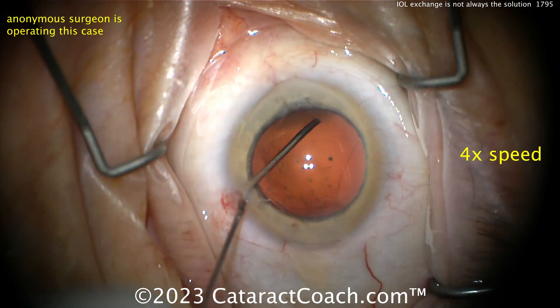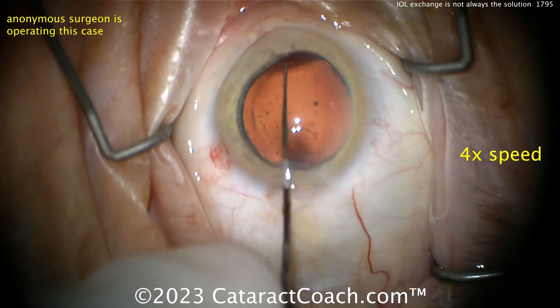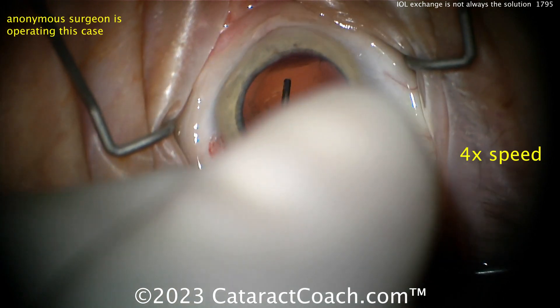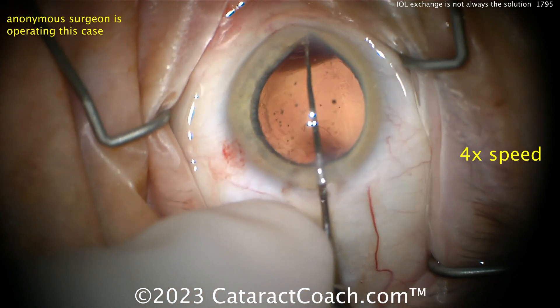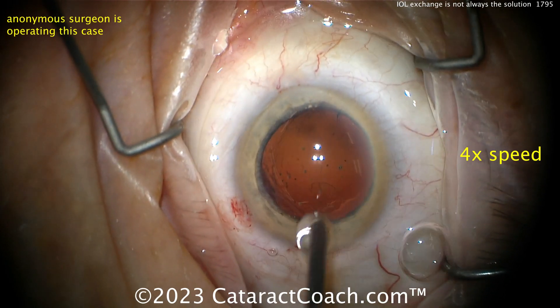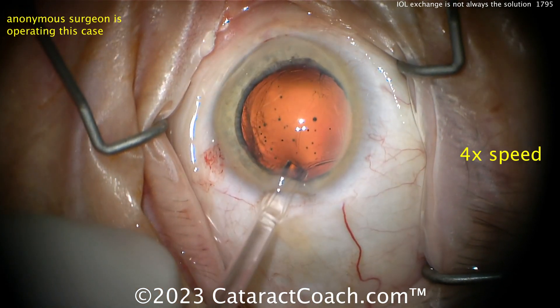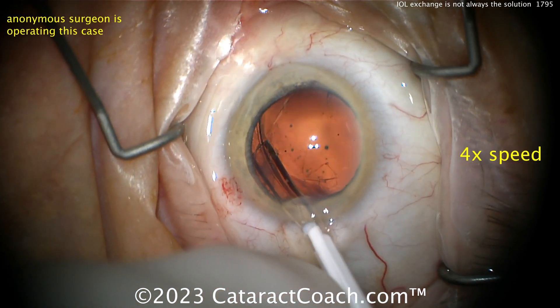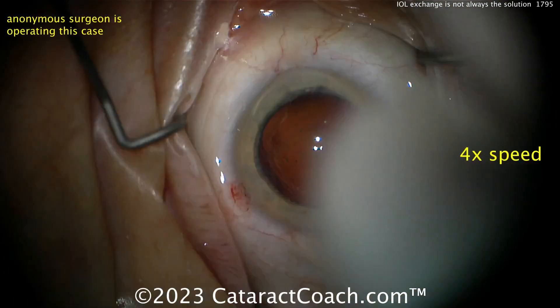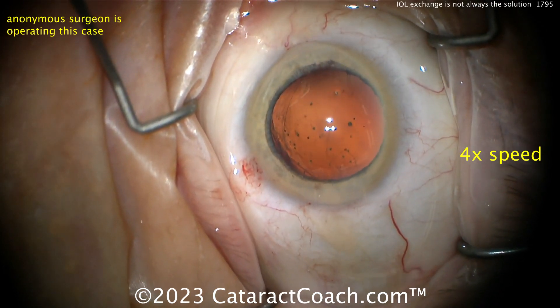The capsular bag is being filled with viscoelastic. A little bit of polishing was done — I don't know if you need any polishing. More viscoelastic, let's get the new lens in. Not sure what's going on with that hook near the iris. A CTR is going in — I don't see the upside of this with a contracted capsular bag. And given that the rhexis enlargement went way out to the zonules, are you sure the CTR is okay? I'm not sure, but I'll trust your judgment.